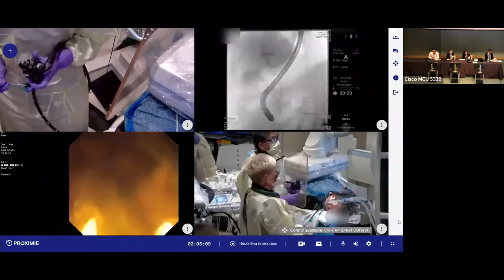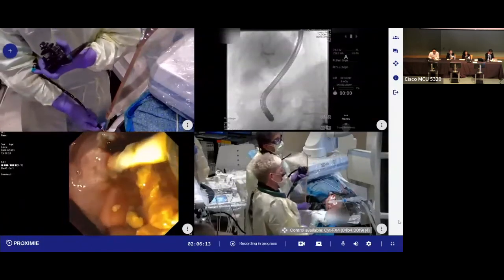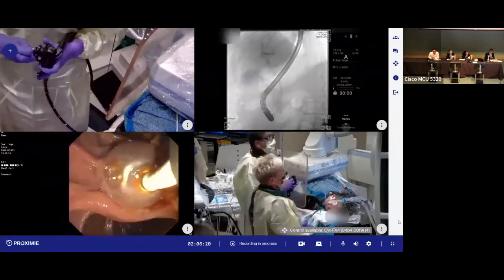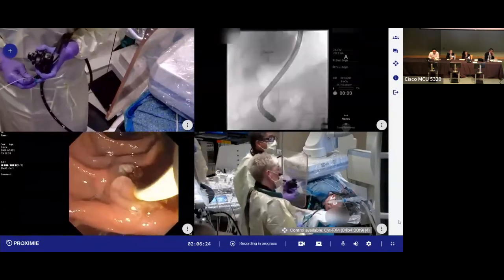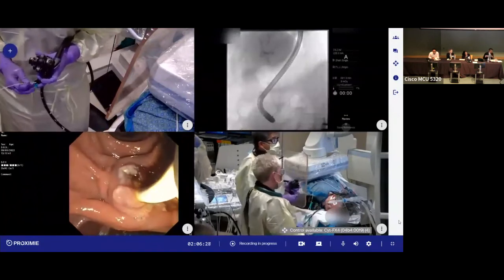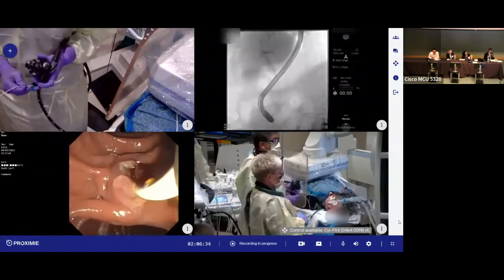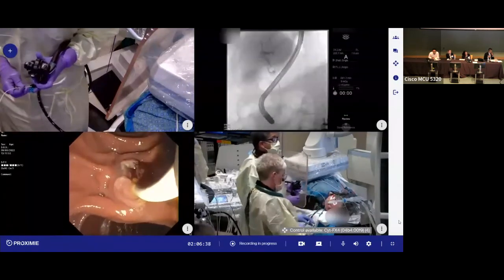Oh, you got it. The question was related to small stones in a markedly dilated duct. And sometimes those are harder to come out. You're at 9 though. Those are harder to bring out. So sometimes you have to use a basket, or it might actually increase the balloon dilation even more, to try to get those smaller stones out. Yep. A lot of times also give a little bit of contrast, and if you've got a decent sized sphincterotomy and outlet, try and tap suction and utilize suction to transmit negative pressure into the bile duct to pull those stones down below the tip of the balloon. That's good. Okay. Good.